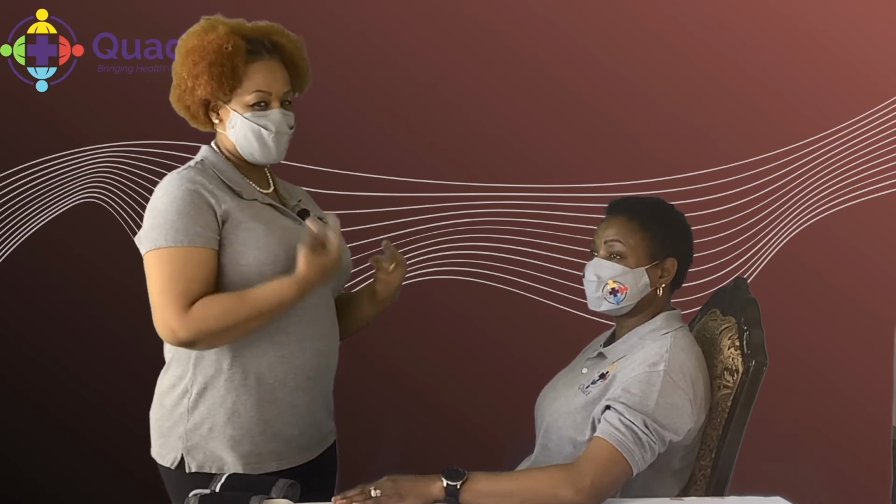Hi, and we're back. I'm Katina, and I have Miss Jeanette Williams here with me. I'm going to be taking her blood pressure. Hi, Miss Jeanette. I'm going to be taking your blood pressure today. Is it okay if I use your left arm? Yes. All right, so I've already washed my hands, and as you can see, we both have our masks on.